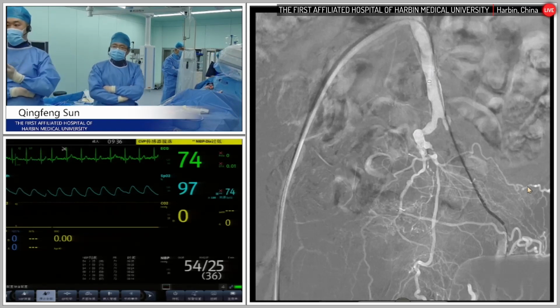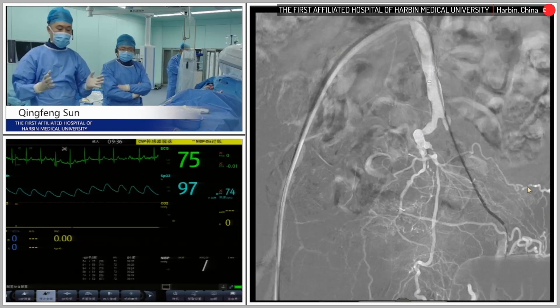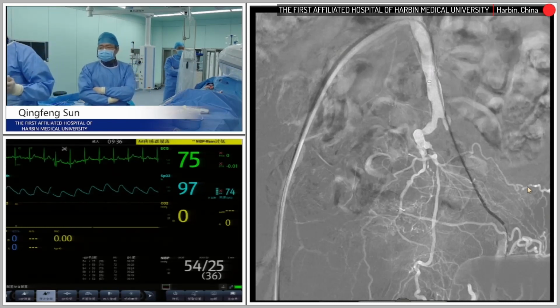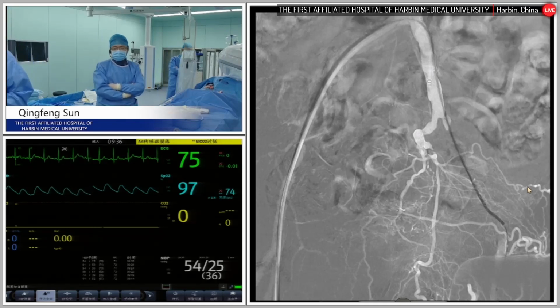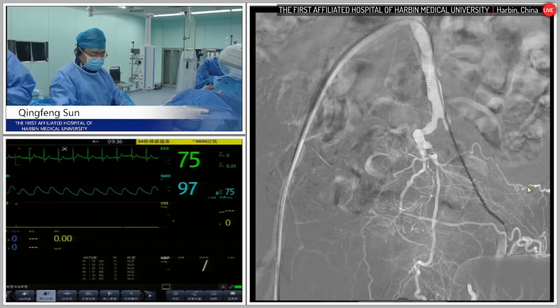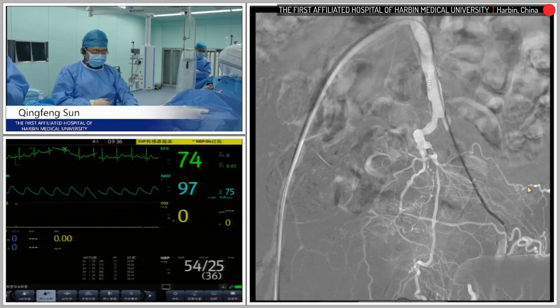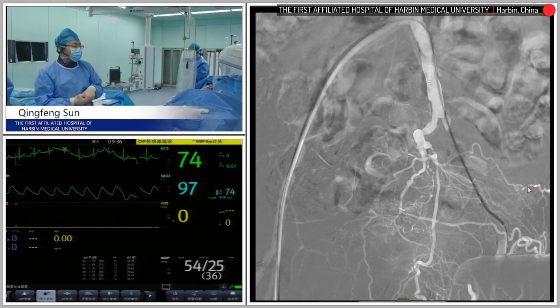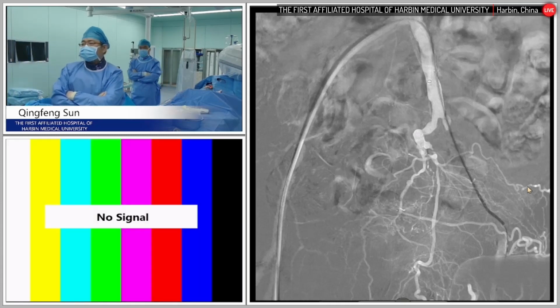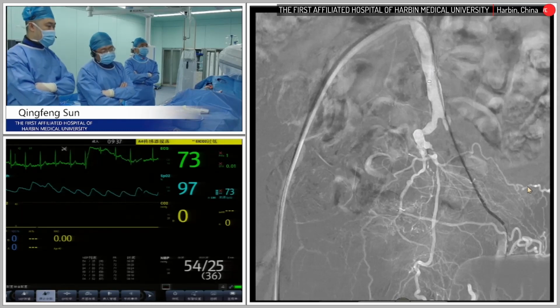So, like you said, the software will probably be good, but right now we are not using it. But if there's a chance, we will use it later. Okay. So I saw some of your live broadcast for the cardiology department. You can actually see the plaque. You can see the calcification using different colors. You can actually remove part of it, right? So maybe it's good. Yeah, it's a very fancy technology. Yeah, it gives lots of information to make your decision on how to treat this kind of lesion.